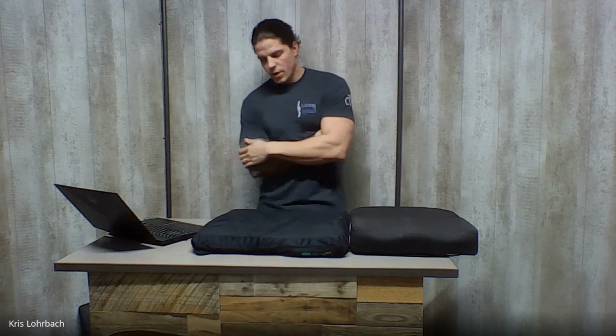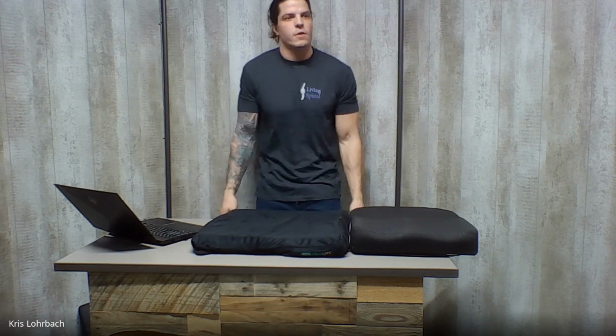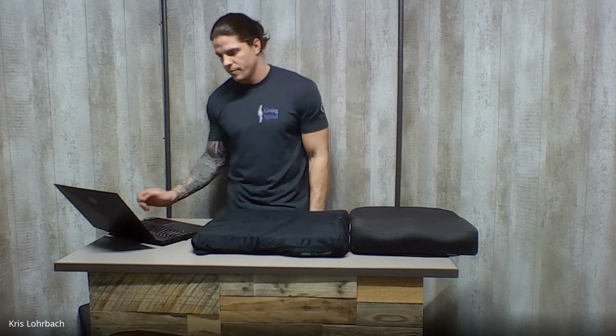I did have one customer where we changed his armrest height, and he had Navi 1s, and he was pretty weak. He got Navi 1s because it was hard for him to push, and just that slight change in where his elbows were, it was harder for him to push his rims. So we had to return it and do a different profile cushion. Not everyone's going to be like that. That's an extreme case, but it can happen.